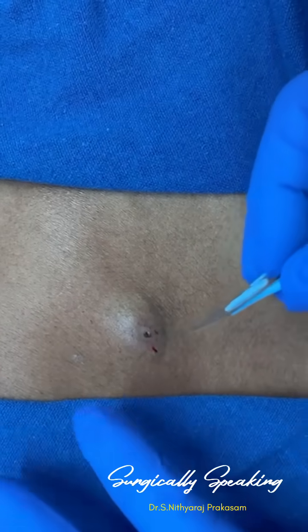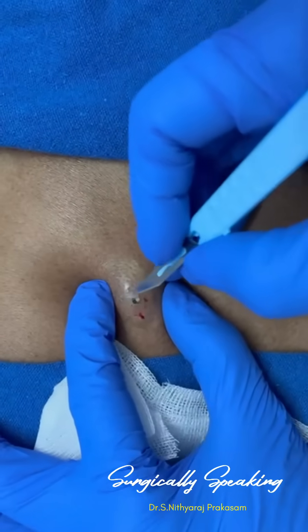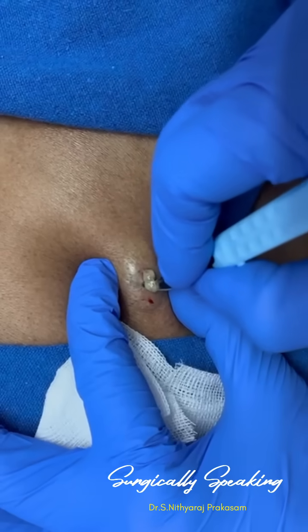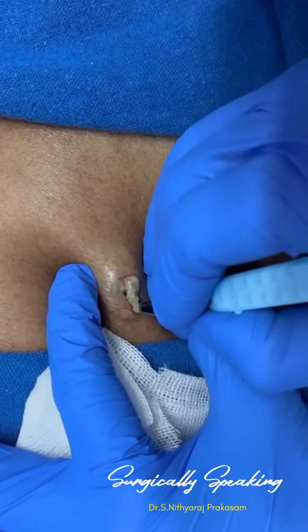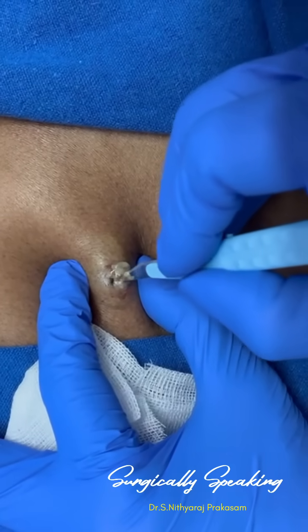Okay. Now we are ready. Now give me a gauze. Now I am going to make this cut here. You can see even as I press, the fluid is coming outside. This is the infected material that was inside the sebaceous cyst. You can see that my patient is very, very comfortable.